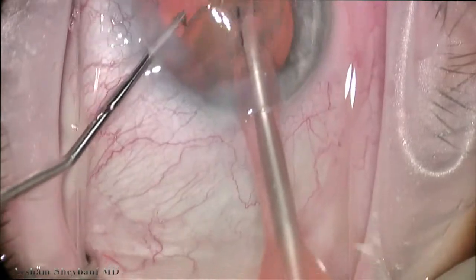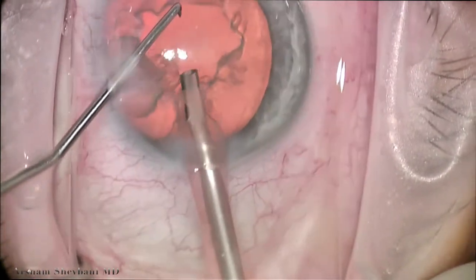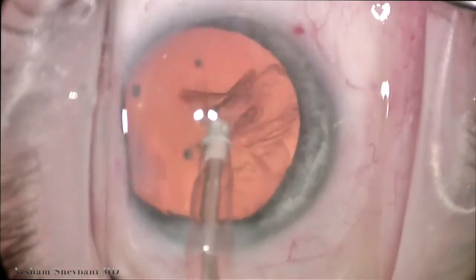Again, we're able to emulsify this nucleus fairly easily after just doing one chop. And the Milder chopper is great for all types of surgeons — it really is my preferred chopper.